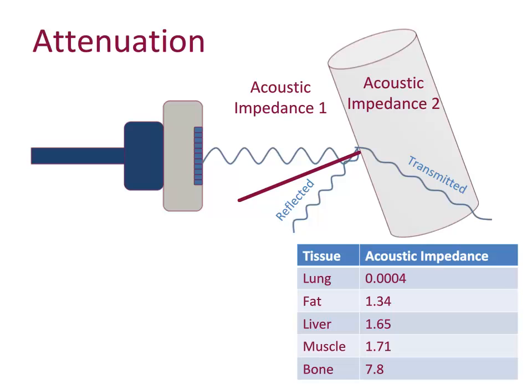That is, we use the time it takes an ultrasound wave to reflect back to us to determine the distance between us and the reflector. So, the main principle of using medical ultrasound is to detect reflected sounds. Here, the strength of the reflection matters too. Stronger reflections are considered brighter objects than weaker reflectors. A uniform medium does not reflect much sound. It's the difference in the sound transmission properties within the tissue and between tissues that makes sound reflect back. The bigger the difference in sound properties between 2 structures, the larger portion of sound reflected.